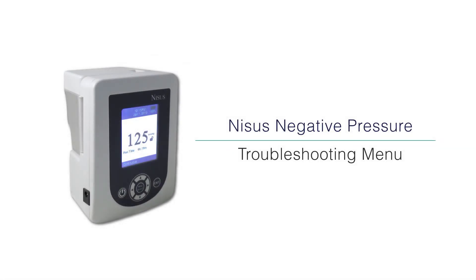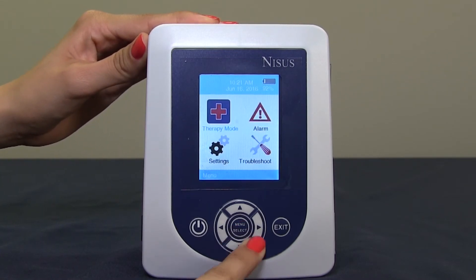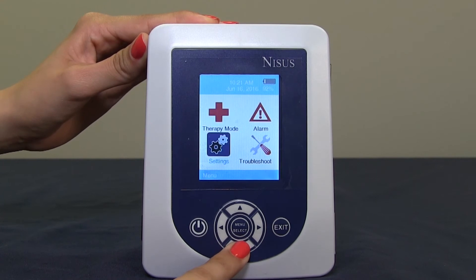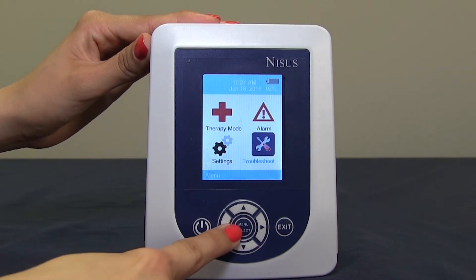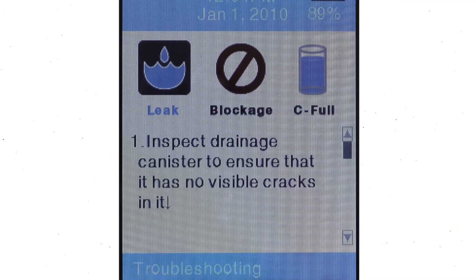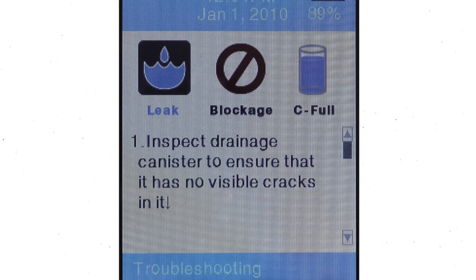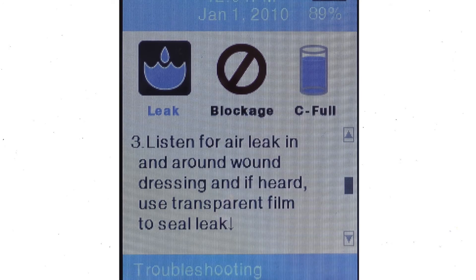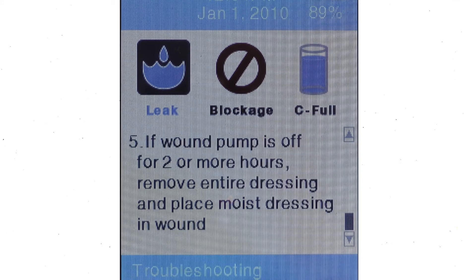In order to access the troubleshooting menu, locate the menu select button, press down, arrow down, and over to highlight the troubleshooting menu. Once highlighted, press menu select. Here you will see the menu for leak, blockage, and canister full. This gives you the ability to read the instructions on how to rectify an alarm by scrolling down.